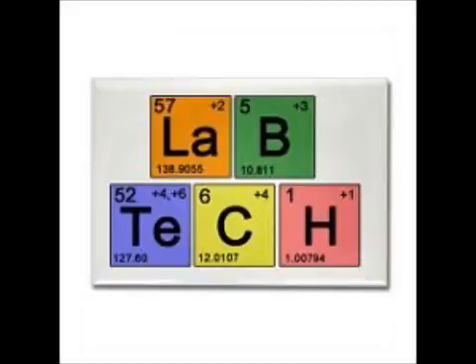Tell me what you know about the specimen for testing. Coag is probably the most critical, because your specimen is the first thing that affects your results negatively. So why does the tube have to be filled 90%? Does anybody know why? It's a 9-to-1 ratio of blood to what anticoagulant? Sodium citrate. If you don't keep that 9-to-1 ratio by having a full blue top tube, you're going to have too much anticoagulant, and in the testing it's going to make it look like the patient has a clotting deficiency.